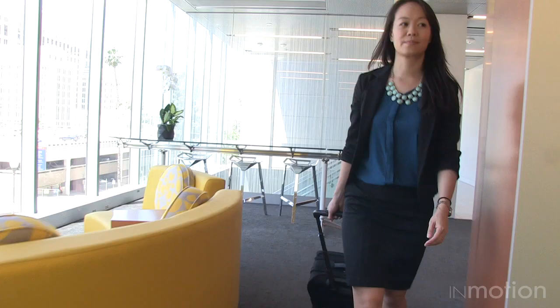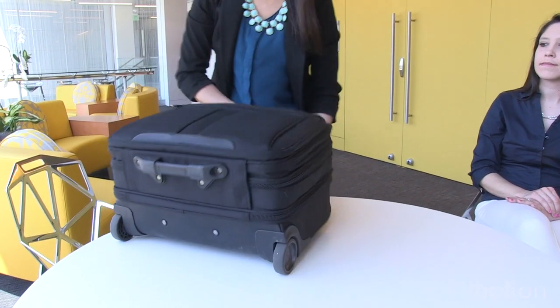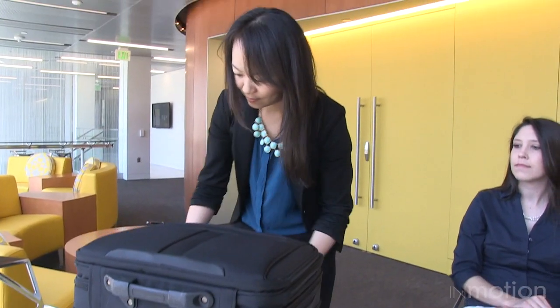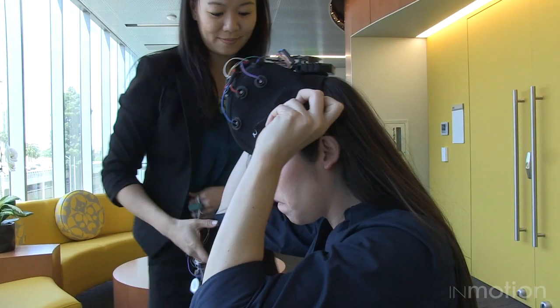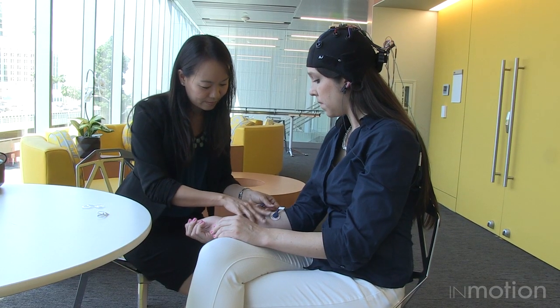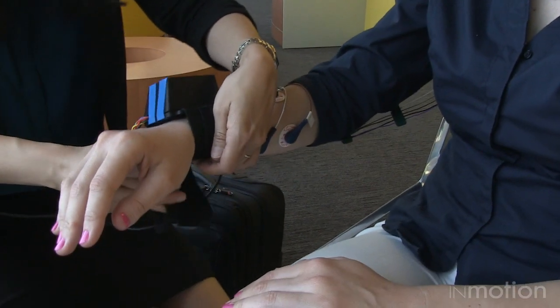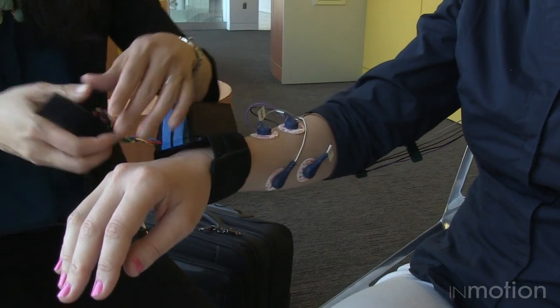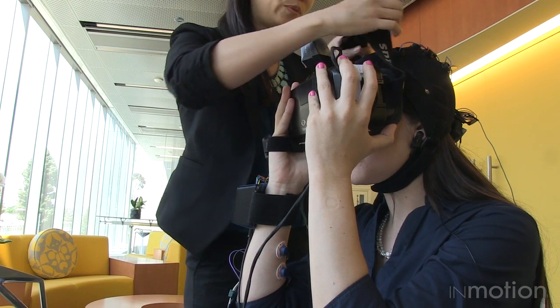After the initial assessment, we would wheel reInvent to a room with the patient. We first go over the procedures with them so they know what's going to happen. Just take out the laptop, which runs all of our software and runs the virtual reality software. We also would just put on an EEG cap, and then we put on the electrodes onto their muscles, and we put an IMU on their wrist, so this tracks their movements. And then finally we put the virtual reality headset on them. There you go, and I'm just going to pull this over.